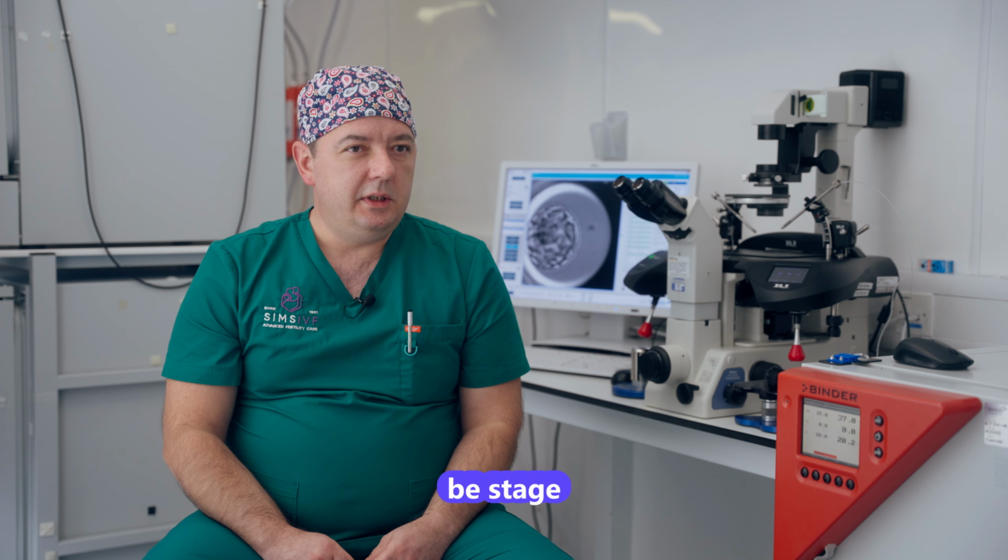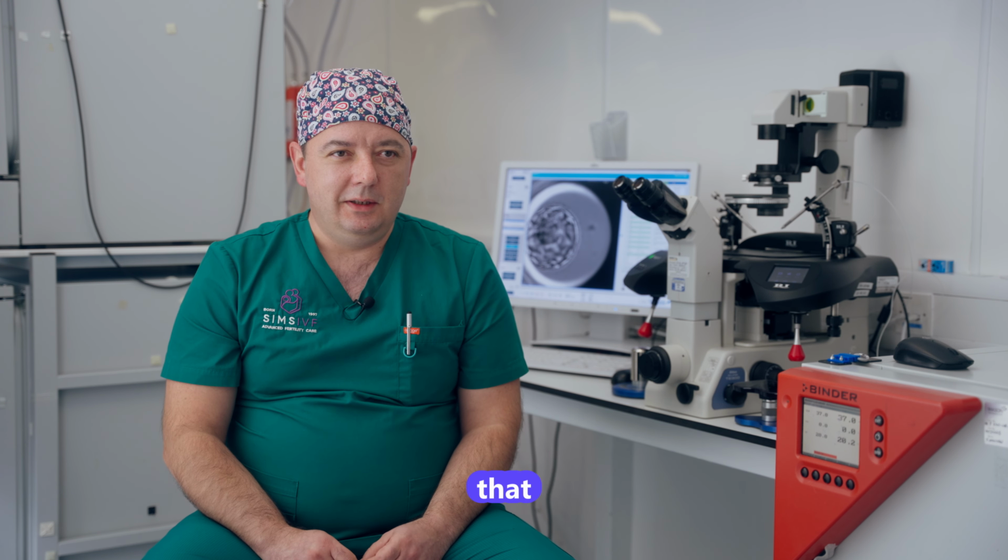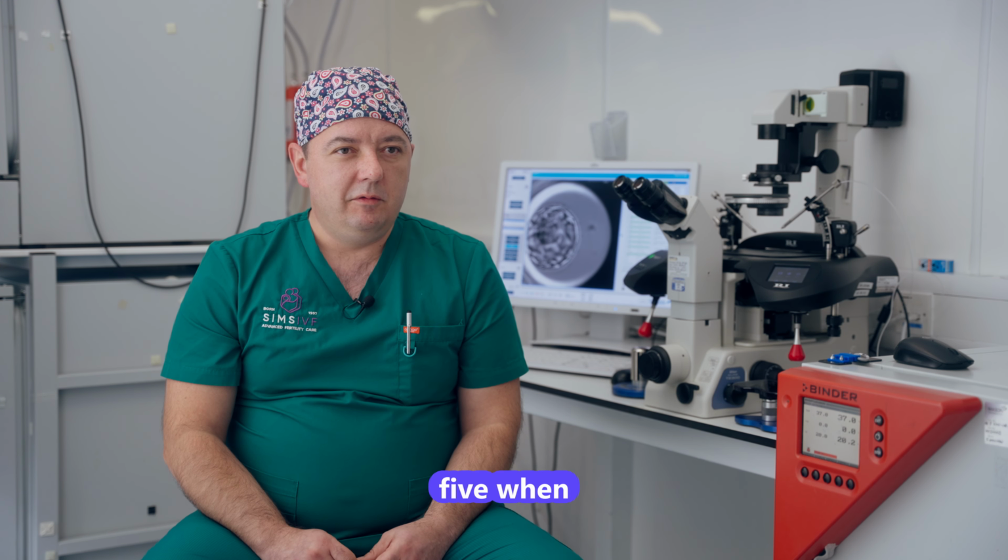the first stage where you can actually grade the inner cell mass and the trophectoderm. And then the embryo just expands more. It may increase the volume. That's going to be stage 4, which is the expanded blastocyst. And when they start to breach the zona that protects the embryo in the first 5 or 6 days, that's called stage 5, when it's hatching.